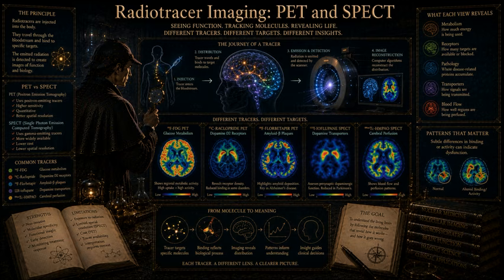But a tiny microscopic flash of ultraviolet light deep inside a machine doesn't give a computer a digital data point. It's too faint, surely. It is far too faint. We have to convert that optical light into a robust electrical current, and we have to amplify it massively. For decades, the standard technology for this has been the photomultiplier tube, or PMT. Right, PMT. A PMT is a brilliant, almost retro piece of vacuum tube engineering. The faint light from the scintillating crystal strikes a photosensitive cathode at the front of the evacuated glass tube. The energy of the light knocks a single electron loose from the cathode.